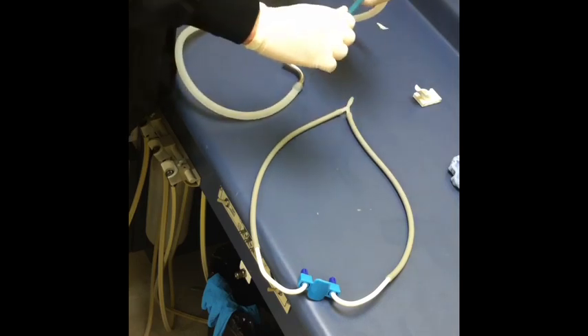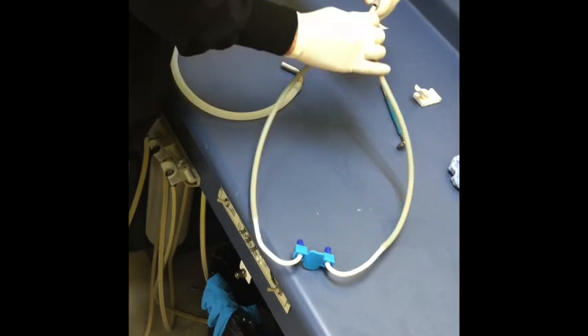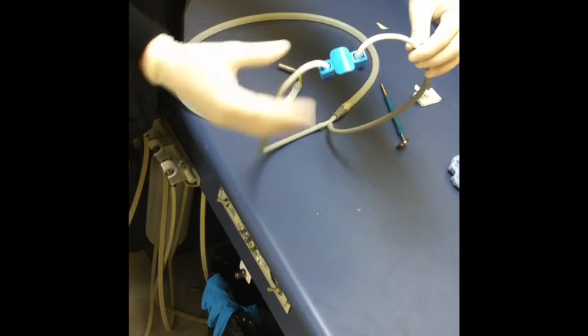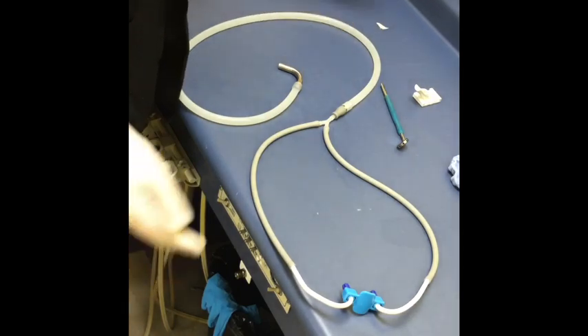I use this for the posterior sextants to scale, then I just detach and put this in the same adapter and use the Kona block for the anterior teeth to scale. It's a very quick, efficient system, and very cheap to buy.